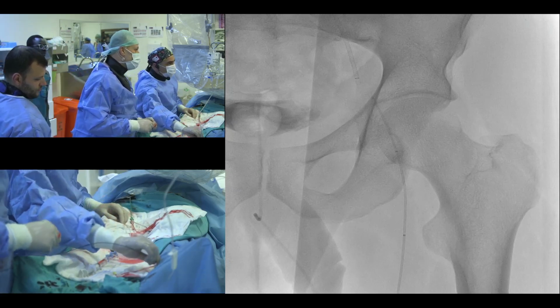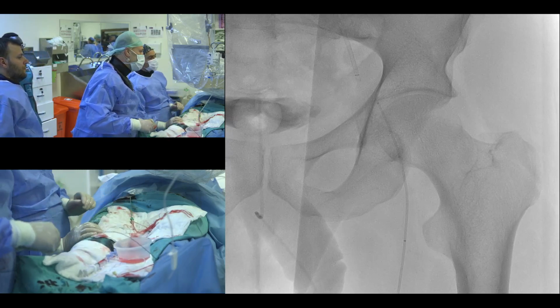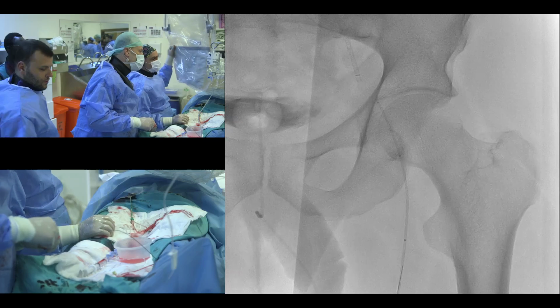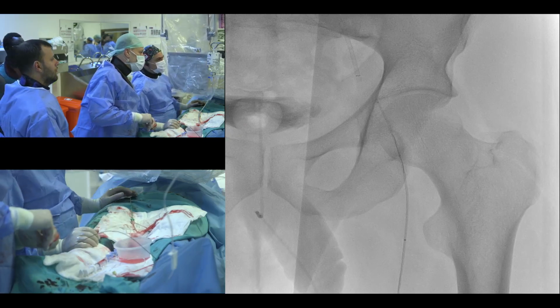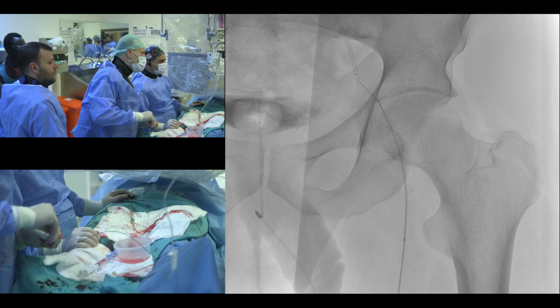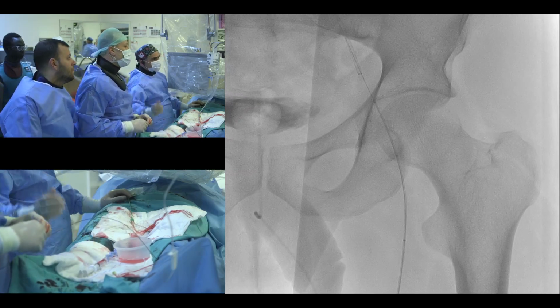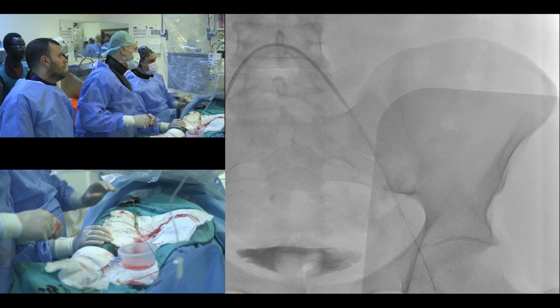Biraz katını geri al istersen, loop'u daha şeyden alırsa. Olmadı. 014 hidrofilik floppy tarzı. Belki 18 girer buraya, rahat girer. Evet, tamam. Tamam, harikasın. Çok perfect, çok güzel. Görelim, gördüm. Gel dön yukarı. Aşağı kası göster bize. Congratulations.